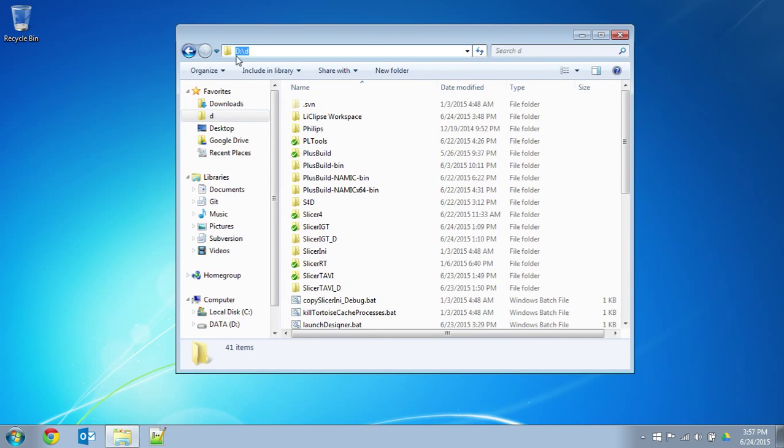So I have a very short path here so that I can build Slicer in Windows with no complications due to path length problems. But most importantly, I'd like you to note the two paths related to my extension that I'll be demoing here today. This is my checkout folder, and this is my build folder.